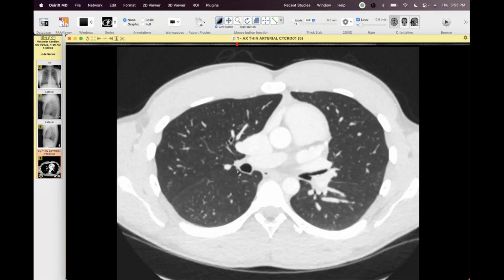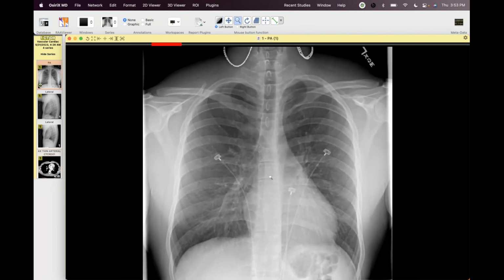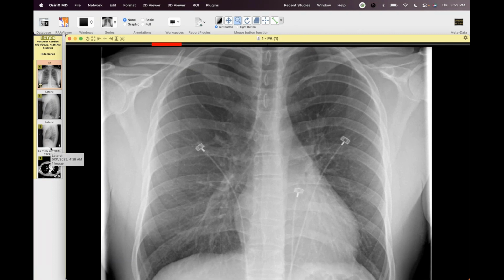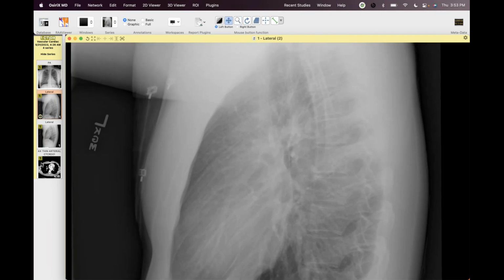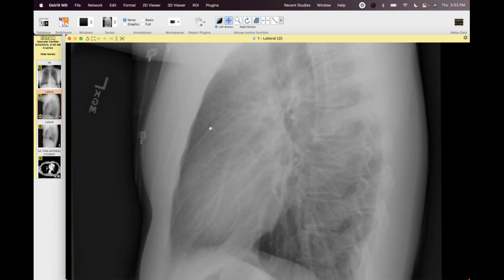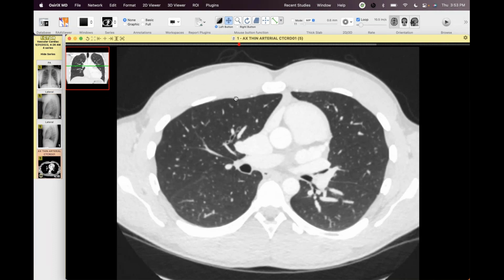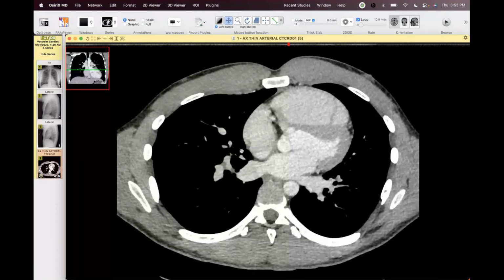Can you, just for fun, show the frontal radiograph of the chest? I don't think we'll really see anything. Do you think the vessels are a little plump? I wouldn't have said anything there for a shunt. The RV's not really that big, but it's just an unexpected finding. I should say too that in this patient, both the right middle and upper lobe are draining into this vein. It's a pretty sizable left to right shunt there.